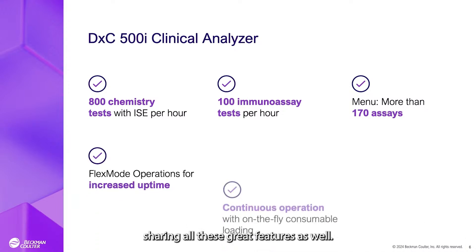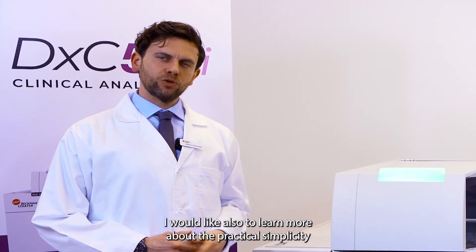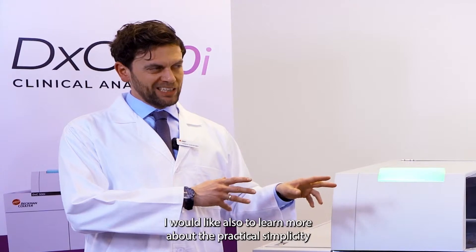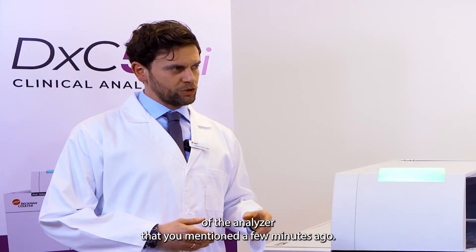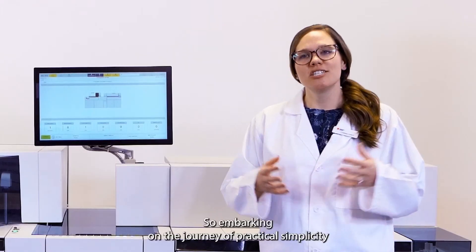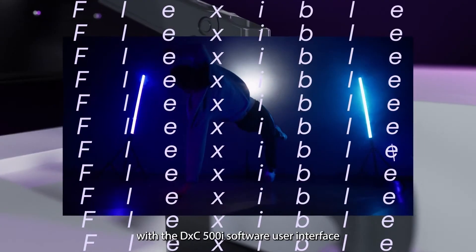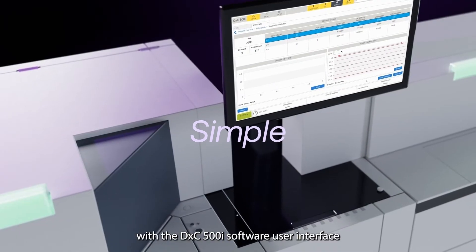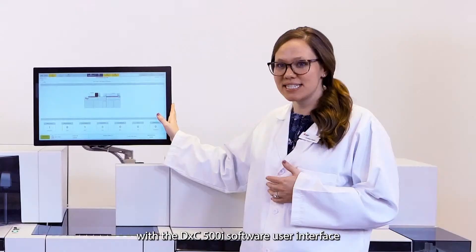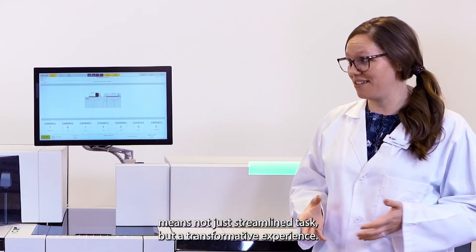Thank you very much for sharing all these great features. We learned a lot about FlexMode Operation. I would also like to learn more about the practical simplicity of the analyzer that you mentioned. So, how does this really benefit our customers? Embarking on the journey of practical simplicity with the DXC 500i software user interface means not just streamlined tasks, but a transformative experience.